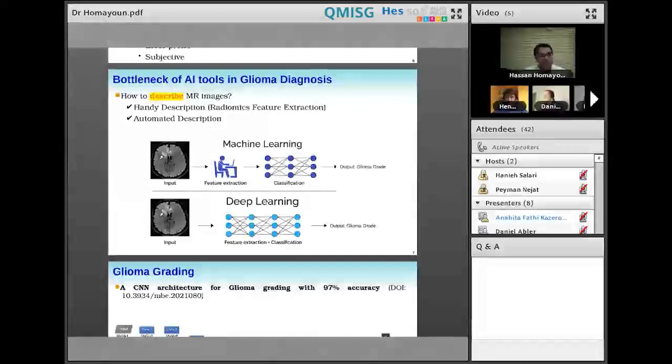You can see from here that there is a gap between the feature extraction step and the classification or modeling step. This gap is a source of many errors. In order to remedy this problem, we can automate the process of feature extraction thanks to deep learning and convolutional neural networks. In convolutional neural networks, the processes of feature extraction and classification are performed simultaneously.